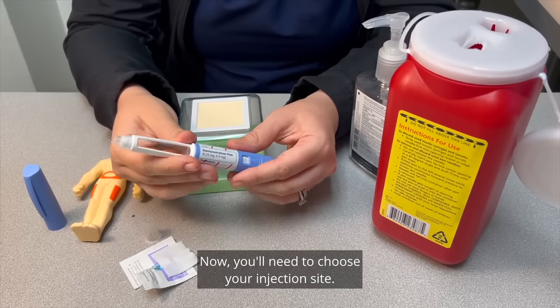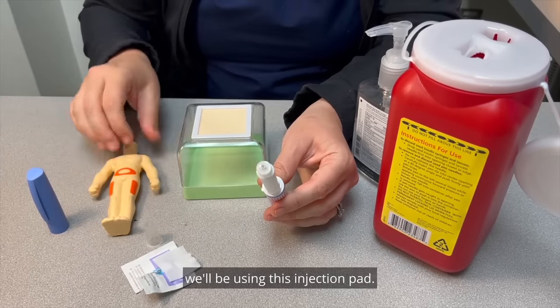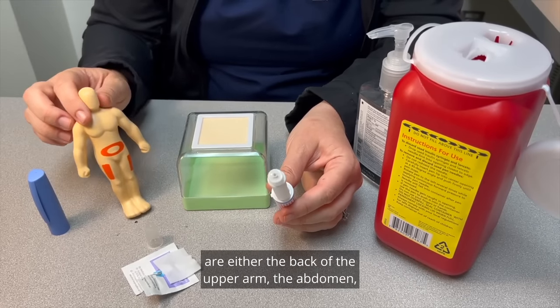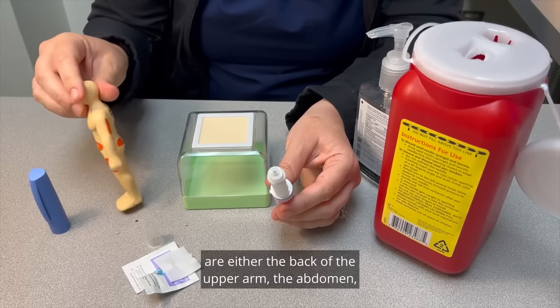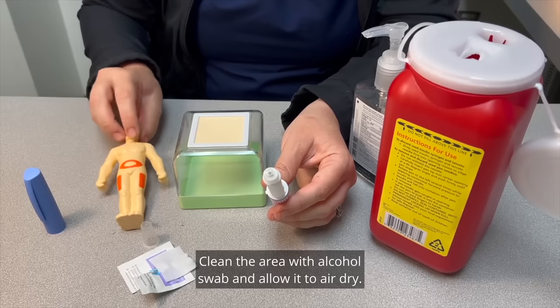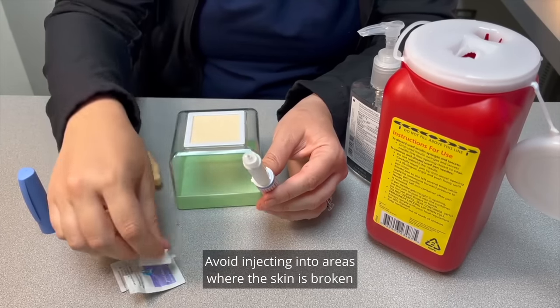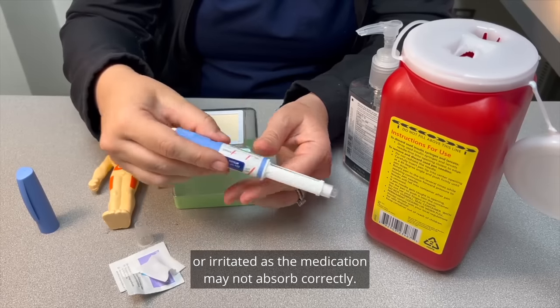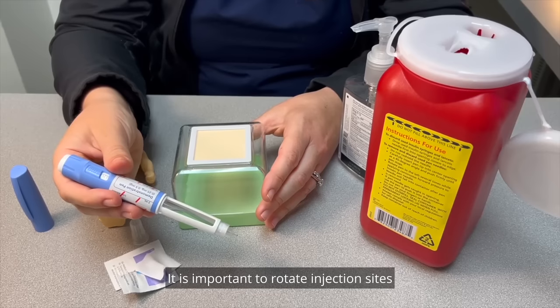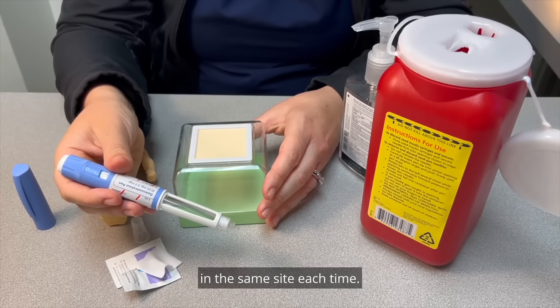Now you'll need to choose your injection site. For this video demonstration, we'll be using this injection pad. The areas where you'll be injecting this medication are either the back of the upper arm, the abdomen at least two inches from the belly button, or the thigh. Clean the area with an alcohol swab and allow it to air dry. Avoid injecting into areas where the skin is broken or irritated, as the medication may not absorb correctly. It is important to rotate injection sites so you're not injecting the medication in the same site each time.